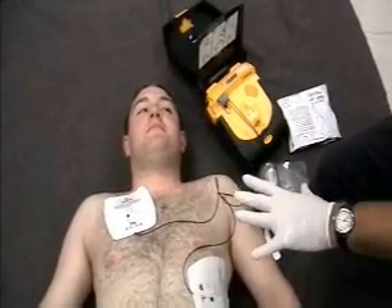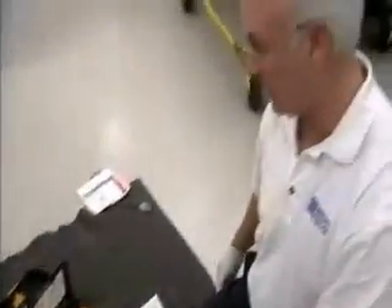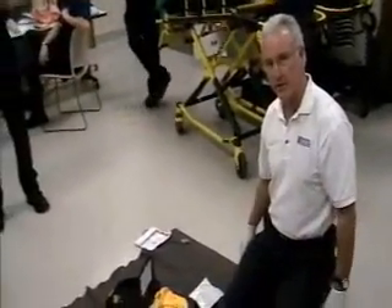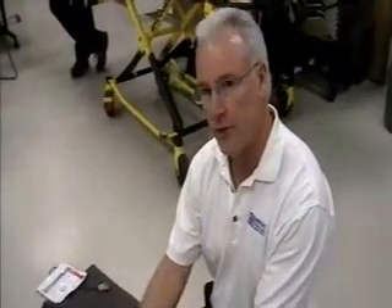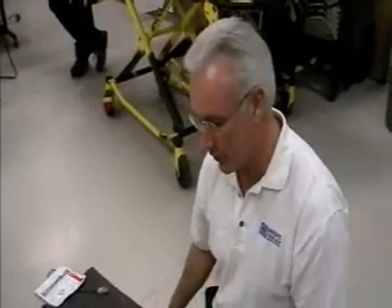So as it is, it's actually evaluating his cardiac rhythm even though he does have a hairy chest. So through the gel adhesives of this particular AED pad, he was successfully able to analyze his heart rhythm.